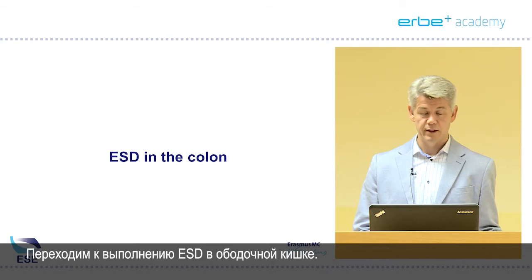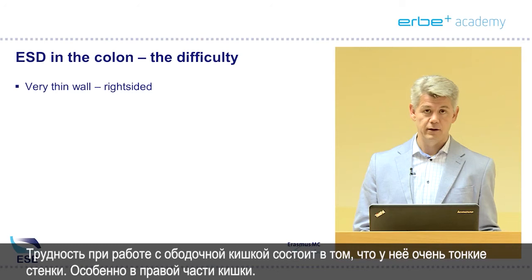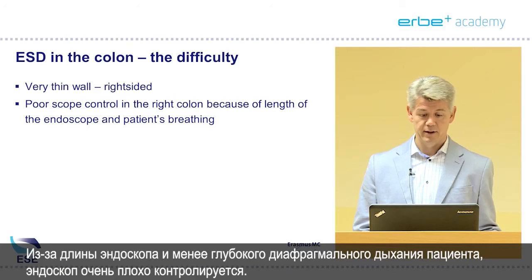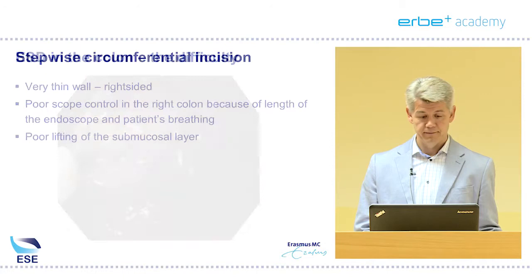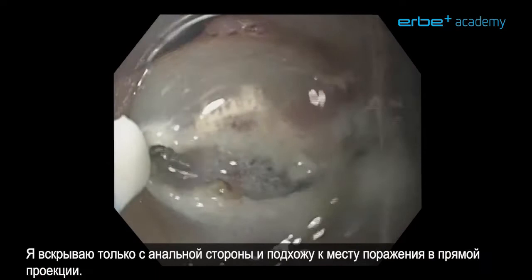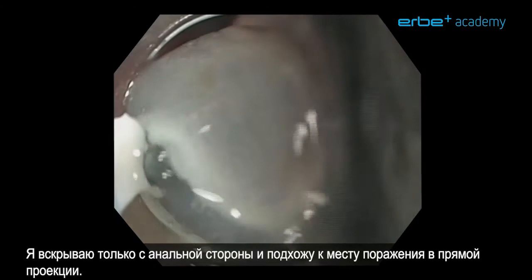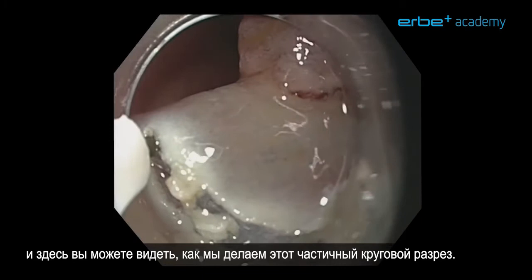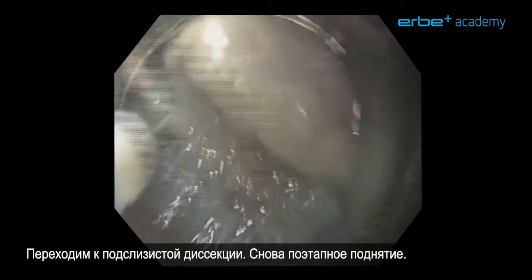We'll move to ESD in the colon. The difficulty is that the wall is very thin, especially on the right side of the colon. There is often poor scope control, especially in the right colon, because of the length of the endoscope and patient breathing lowering the diaphragm. And there is poor lifting of the submucosal layer. For this reason, we choose a stepwise circumferential incision — only opening from the anal side approaching the lesion in a frontal view. We don't need markers because we can clearly distinguish the lesion from normal mucosa.